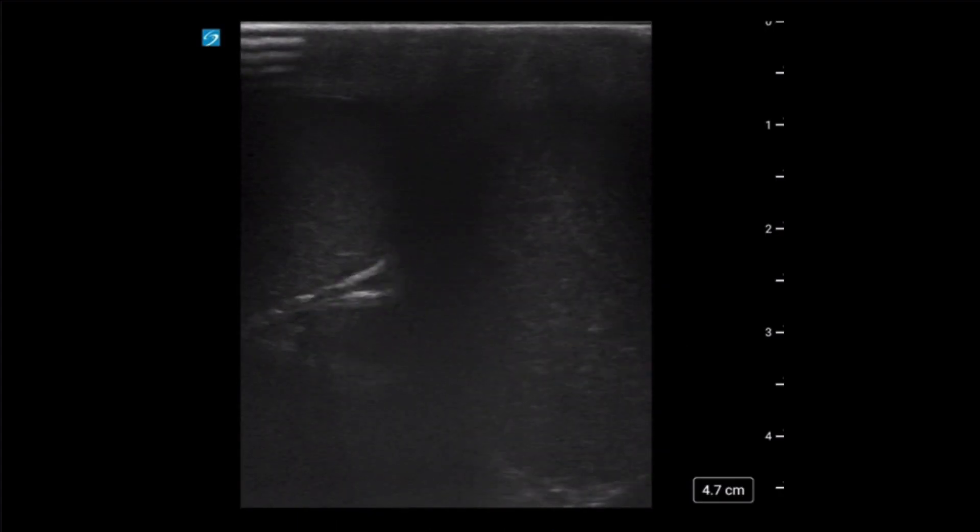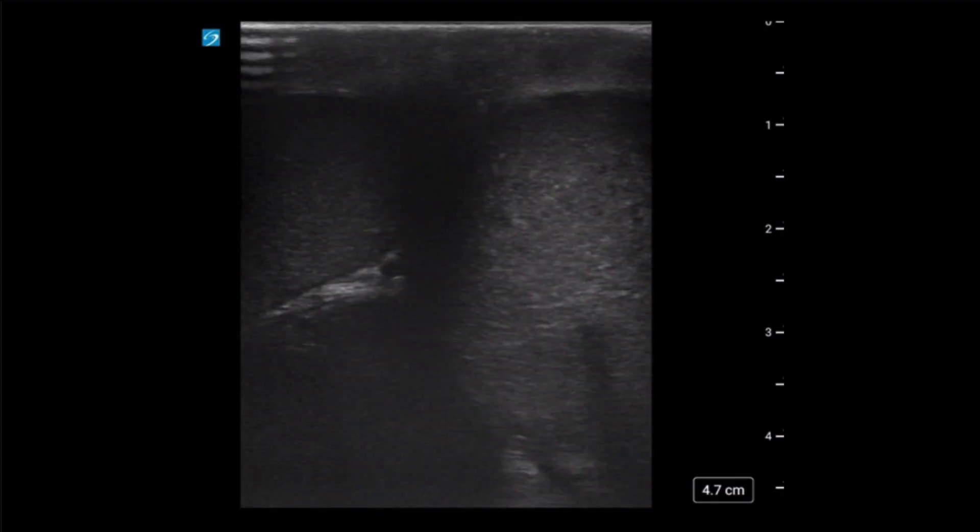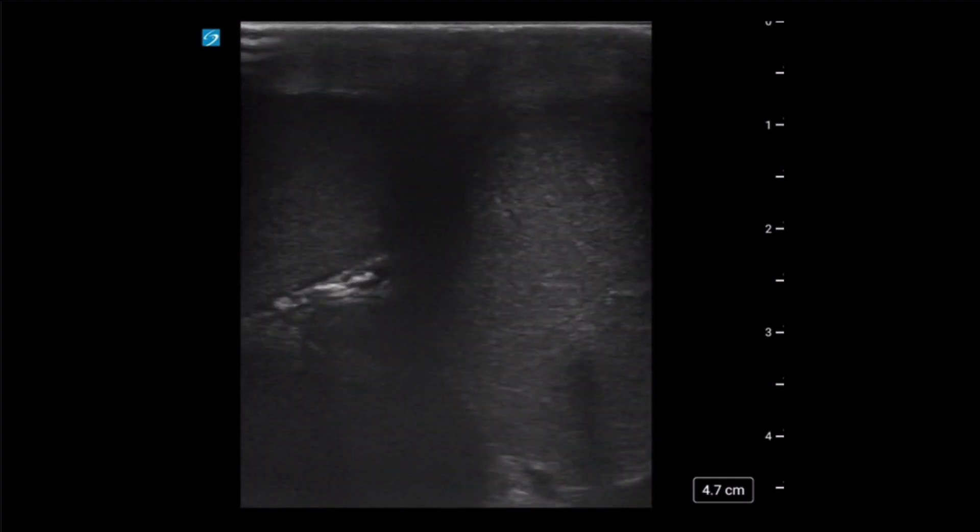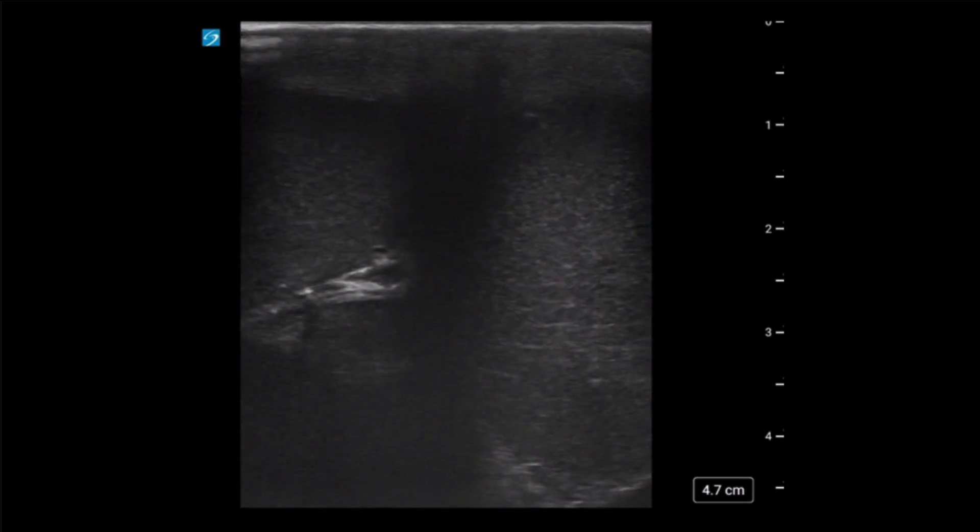By visualizing both testicles, the operator is able to assess relative difference in size and pathology by giving a direct comparison. While this clip does have limitations, a portion of each testi can be seen. By being able to compare each side, we are able to see the subtle difference in echogenicity between the two, with the left testicle being slightly more hyperechoic or bright.